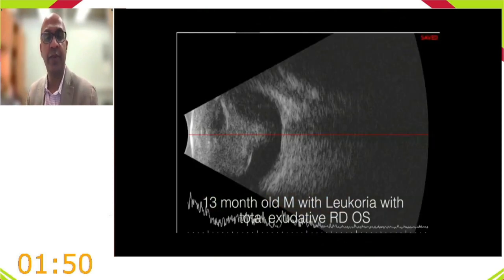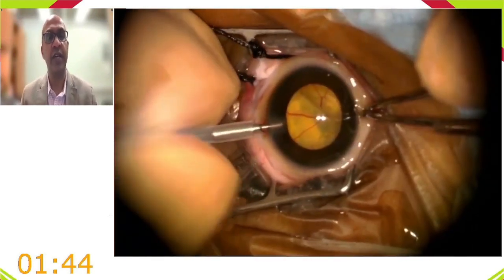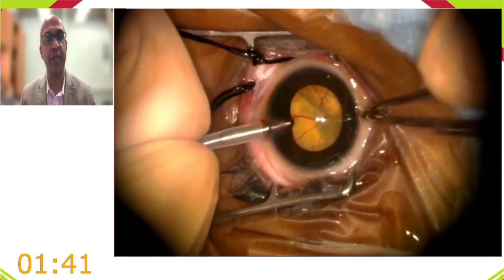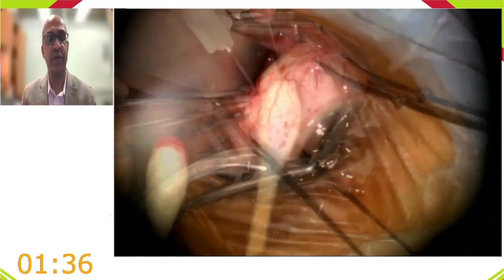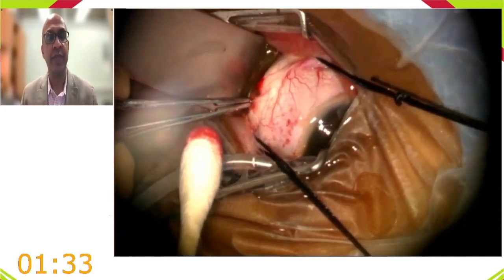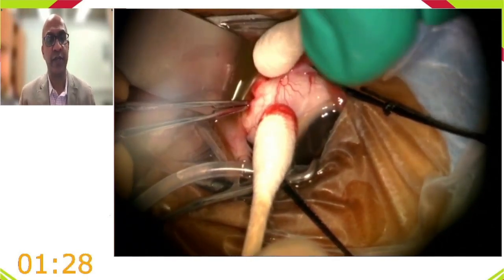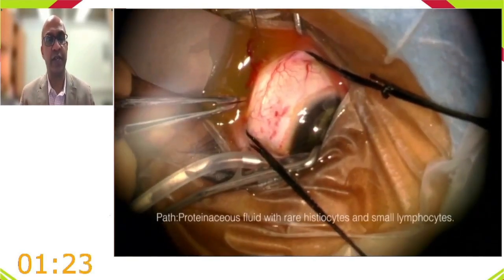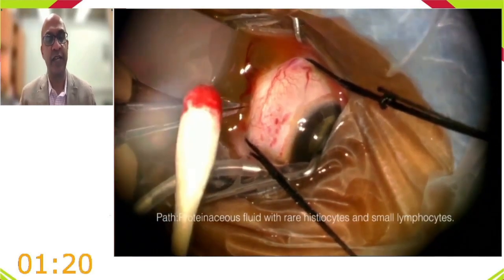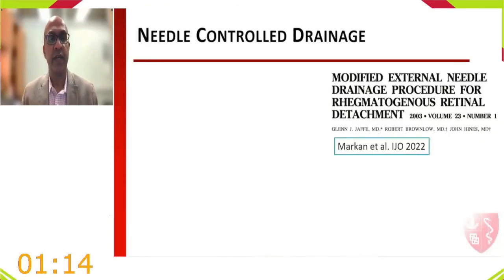A video is shown: a 13-month-old with leukocoria from Coats disease. An anterior chamber infusion elevates pressure, a scleral cut-down is made, and copious yellow proteinaceous subretinal fluid drains through the choroid. This scleral cut-down technique allows flattening of the retina and direct treatment of pathology.